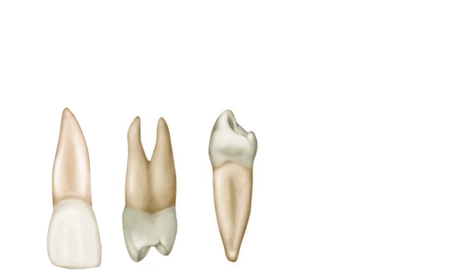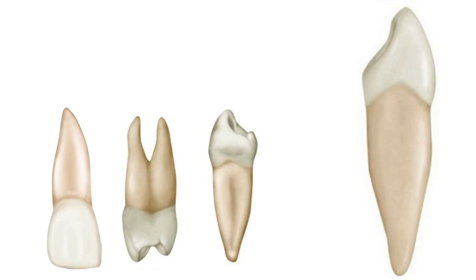Regarding length, shorter teeth allow comfortable pushing of MTA from the coronal or middle third to the apical third. But with longer teeth — like canines with lengths over 25 mm, sometimes even over 30 mm — we may not have pluggers of sufficient length. I have seen cases where an endodontic or rotary file is used to push MTA, but a lot of material gets wasted; pluggers are definitely a better option.